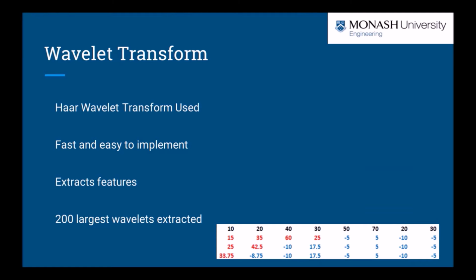The spectrogram matrix is broken down into smaller spectral images, containing a simplified representation of the frequency content with a granularity of 1.48 seconds. These images contain the data used to create a sub-fingerprint. To aid with data extraction, we perform a Haar wavelet transform to extract the approximation and detail coefficients. These represent the big picture and the finer details, so to speak. An example of the Haar wavelet transform can be seen below. The red shows the approximation and the blue shows the detail. The transform process is described in our report.